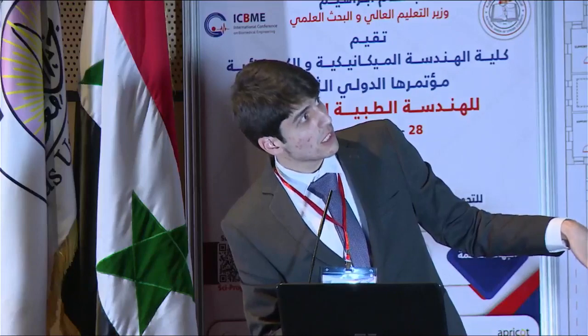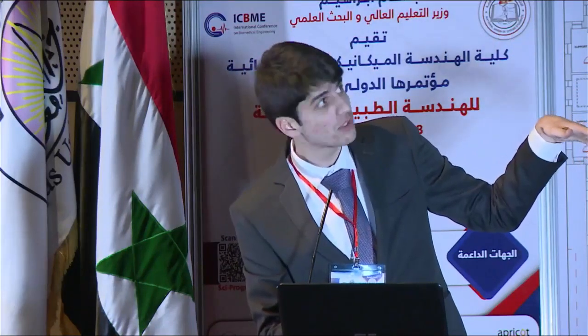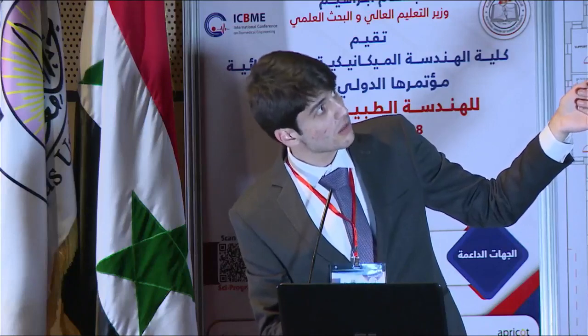Our changes in the prosthetic design: the superior keel, we replace the couple laminates of the superior keel with a single laminate with a thickness of 3 millimeters. The inferior keel becomes 4 millimeters and the posterior keel becomes 6 millimeters. These various thicknesses give the prosthetic limb a more efficient and higher rate of storing the energy and then releasing it at the different levels of the gait cycle.